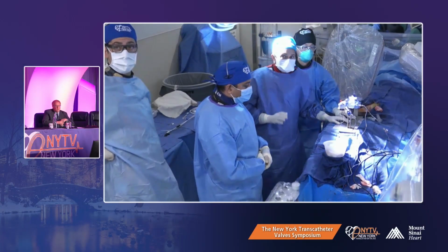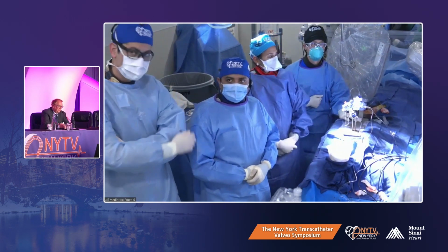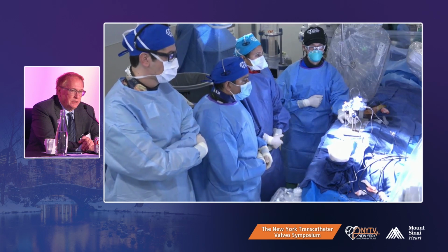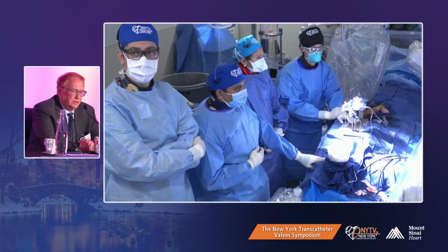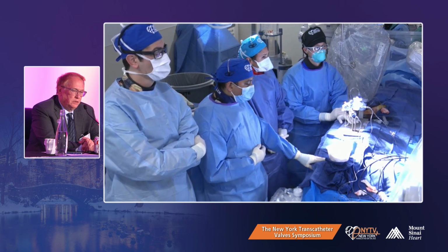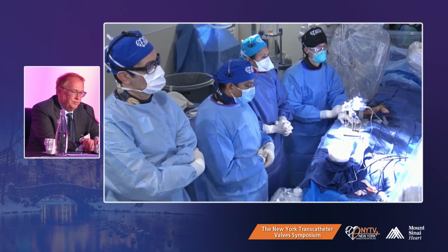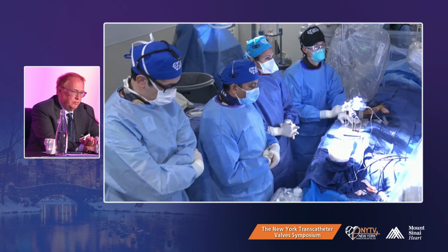Dr. Kinney? Are we live? Yes, we hear you and we see you. Can you see us? Yes. Okay, as the panel had mentioned, when we said we were going to leave, we tried once more reorientation and everything, but it did not help. So we took the whole system out and repunctured. As suggested, even the second transseptal was not easy. First we went with SL, but then we had to go back with the Mullins sheath itself. We went inferior and posterior, more posterior.